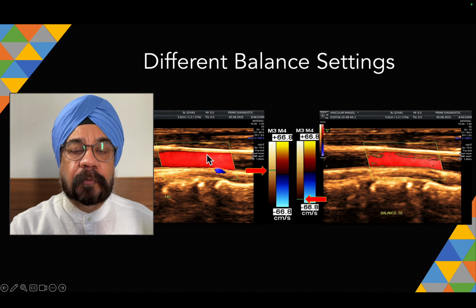Now look at this carotid Doppler. There's a lot of fill. You see under the background there was 2D noise, over which, because we gave priority to the color Doppler to be shown on the screen, the color Doppler now overrides the 2D information in the background.